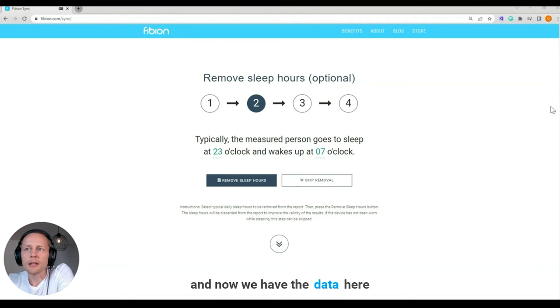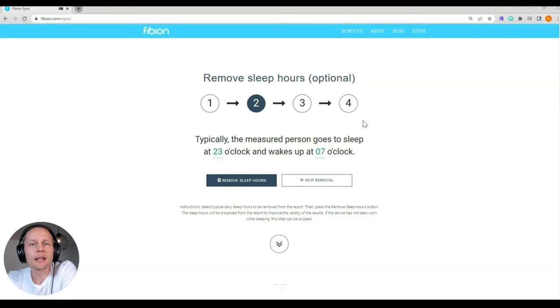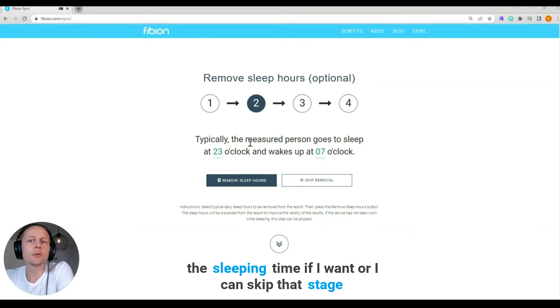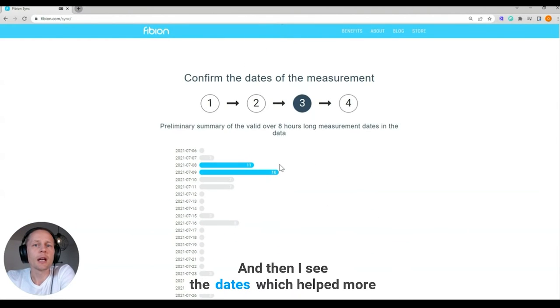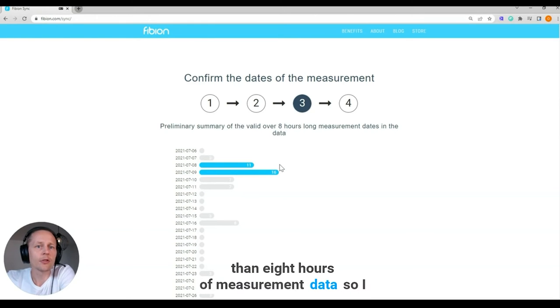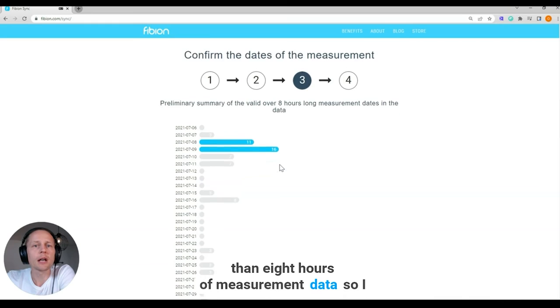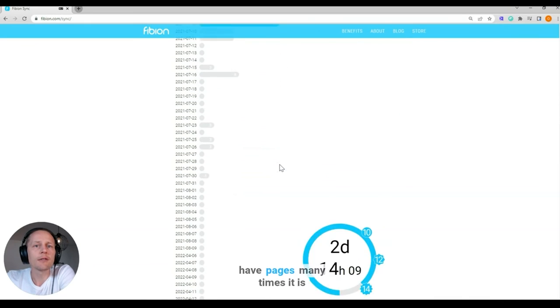Now we have the data here, and I can delete the sleeping time if I want, or I can skip that stage. Then I see the dates which have more than eight hours of measurement data, so I have those dates listed.